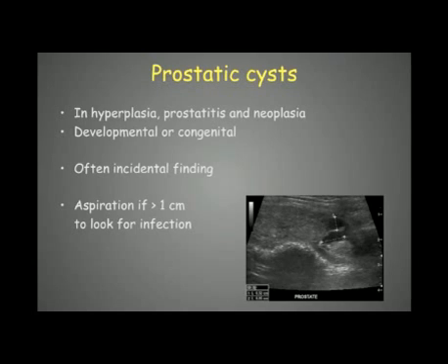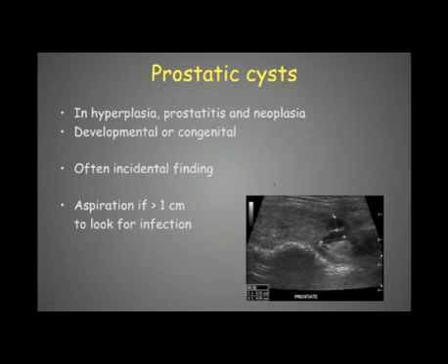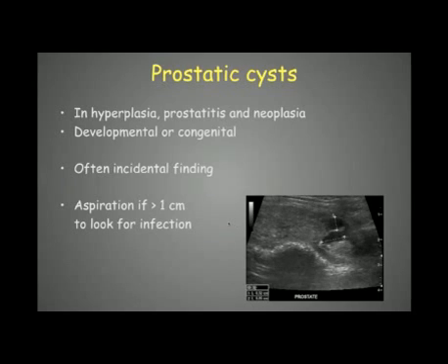Prostatic cysts can be seen in hyperplasia, prostatitis, and neoplasia, but they can also be developmental or congenital — incidental findings with no prostatitis or neoplasia. However, if they are more than one centimeter, it is safer to aspirate them to confirm there is no infection.